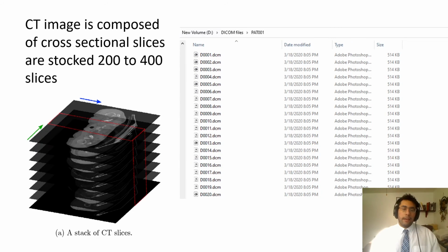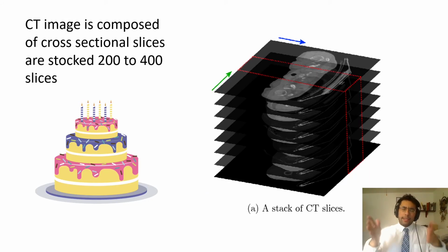The way a DICOM image works is that when a CT scan takes a scan of you from the neck top to the diaphragm, each cross-sectional image is put into order going down into a stack. So one DICOM file represents one 2D image, the next DICOM file represents the next image under that. Kind of like the way a cake is stacked up.